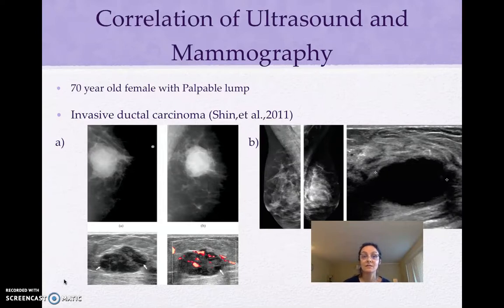In the breast ultrasound department, they work tightly, and they can detect by mammography, and they can find more information about the lesion in the ultrasound, and also after biopsy. So I believe this is really good correlation between these two.